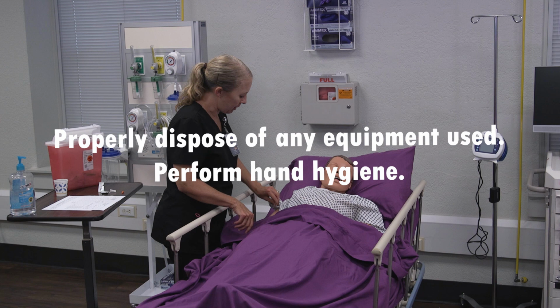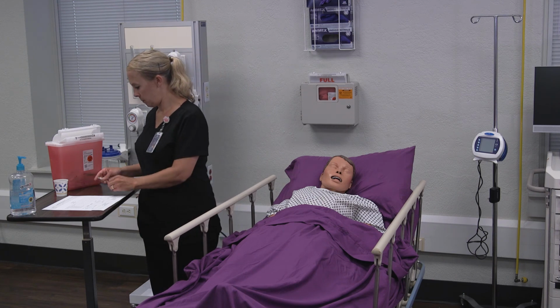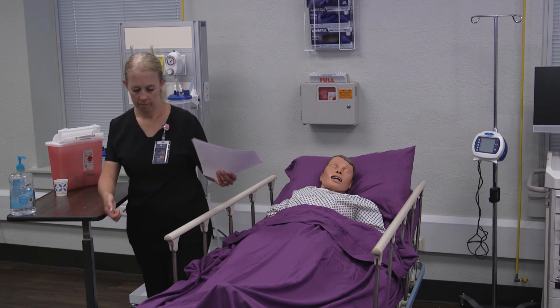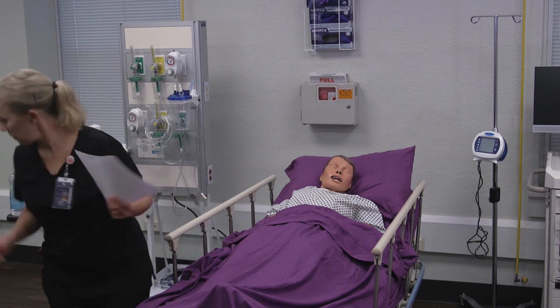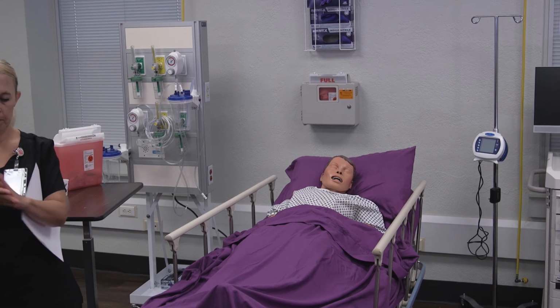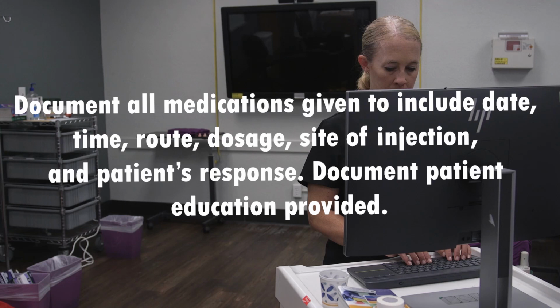Properly dispose of any equipment used. Perform hand hygiene. Document all medications given to include date, time, route, dosage, site of injection, and patient's response. Document patient education provided.